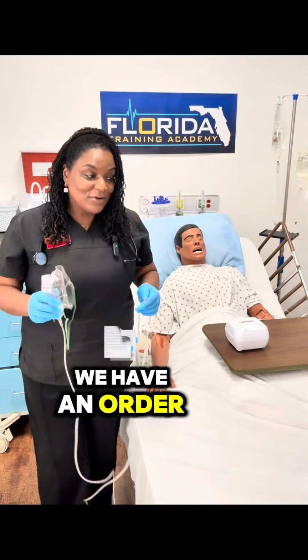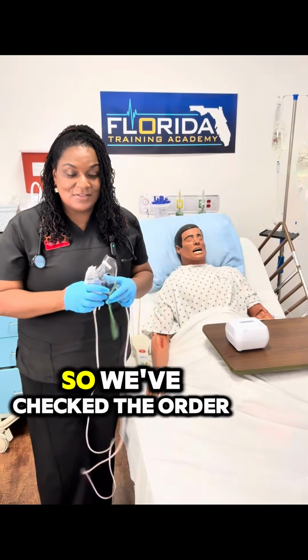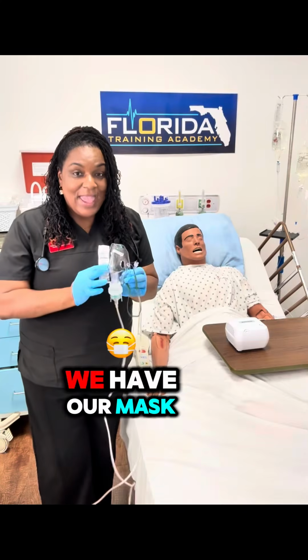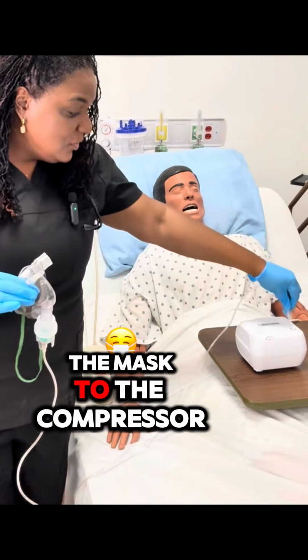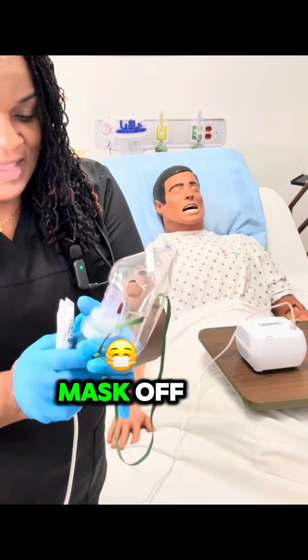So we have an order to administer a nebulized medication to our patient. We've checked the order, we verified our patient identification, we have our medication, we have our mask, we have our compressor. What I'm going to do is connect the mask to the compressor. I'm going to twist the top of the mask off.